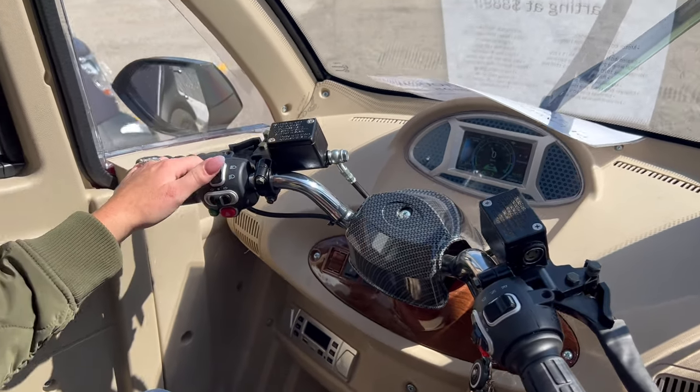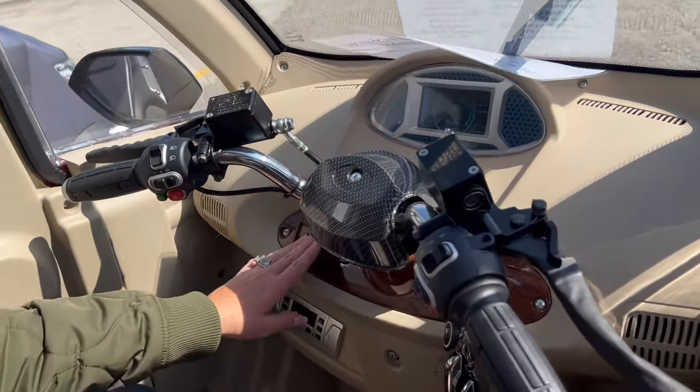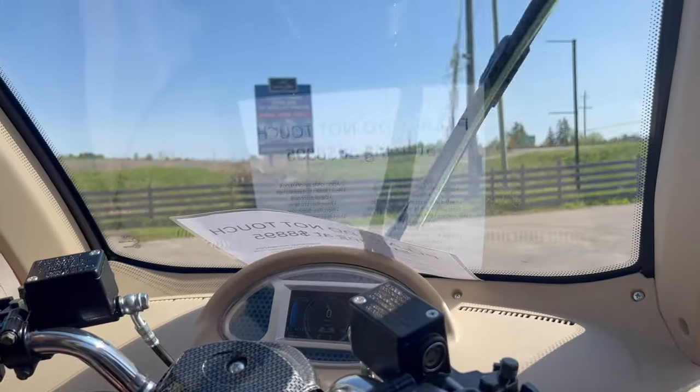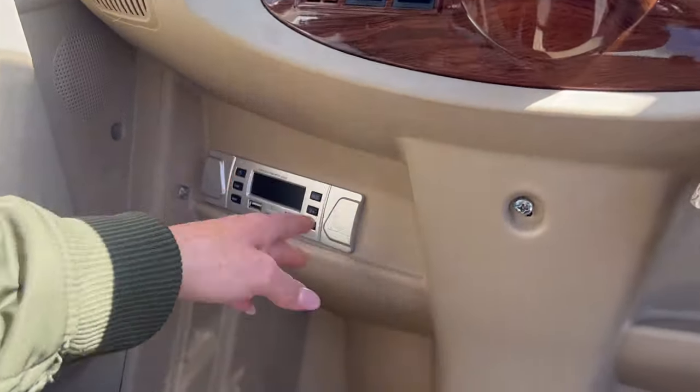You've got hazards, lights, high beam, low beam. You've got heat, you've got windshield wipers — that's kind of nice. Hydraulic disc brakes. You've got your radio and Bluetooth down here.